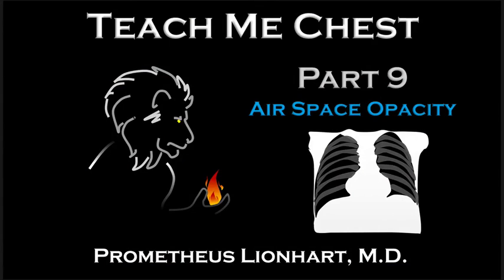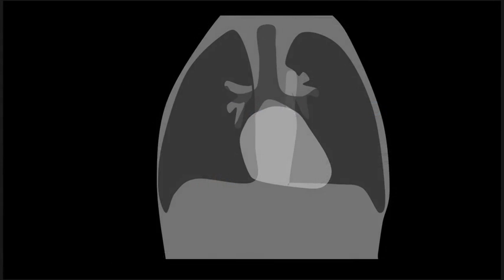Alright, so this is our 9th overall lecture, and the second lecture in our newest series on airspace and interstitial opacities. In this lecture, we're going to focus on the airspace opacity. Let us begin by refreshing memories as to what came before.